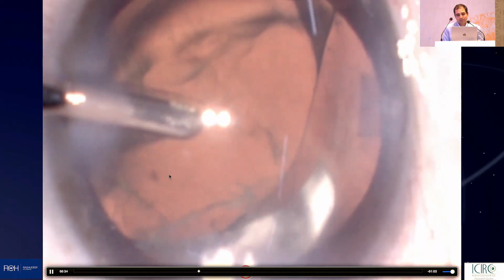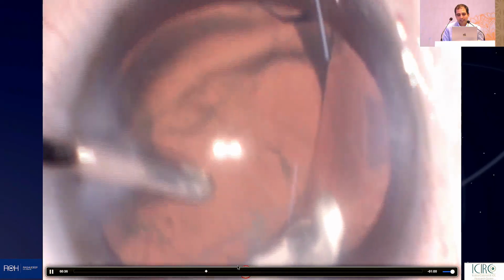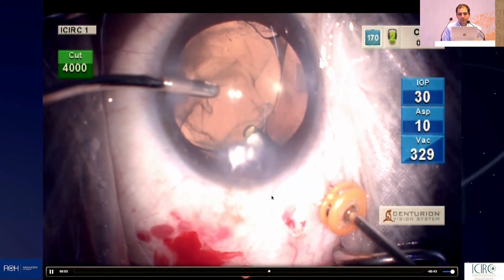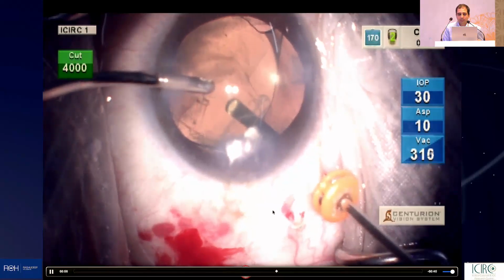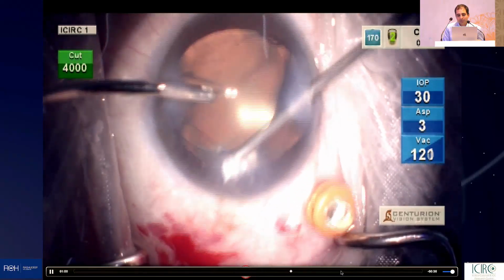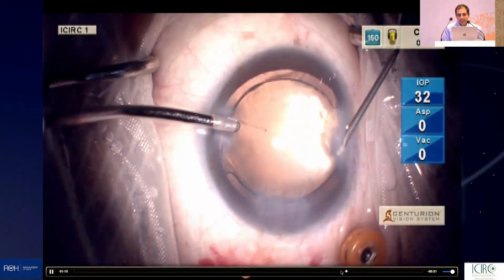means the connection between the posterior component of the vitreous from where it's coming and from the anterior is getting severed. So make sure that once that is severed, you can remove it from the incision from whichever place you like to, and then go back again and do further vitrectomy all around the PCR to make sure that symmetrical amounts of vitreous is removed from all sides.